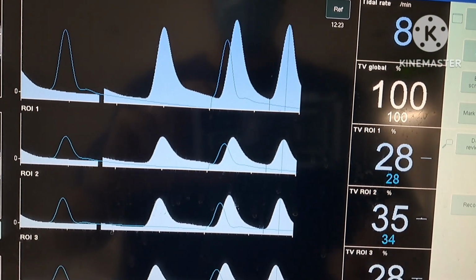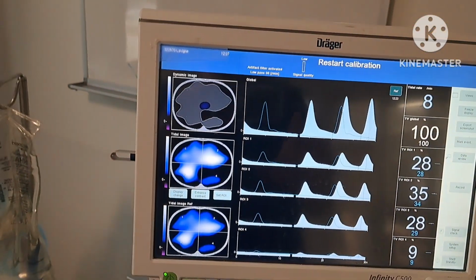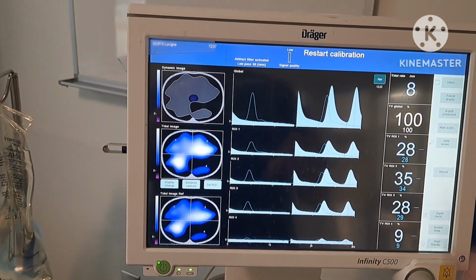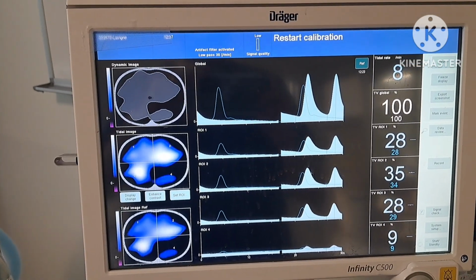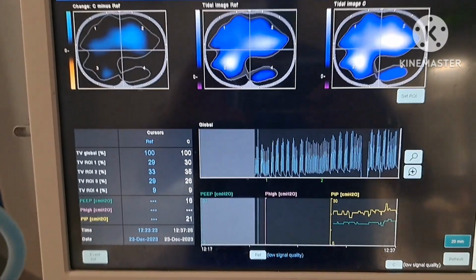So we're not recruiting, but we will set the PEEP where it is still optimal. And okay, we'll let some time go by, and I'll be back in a few minutes.